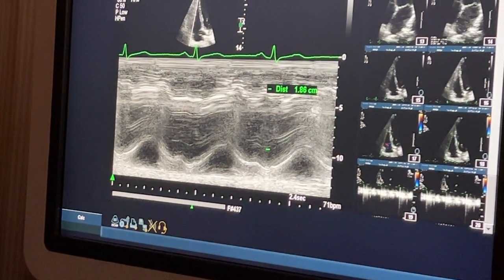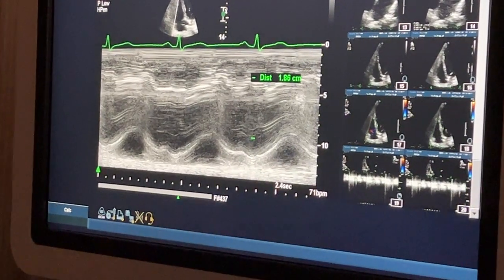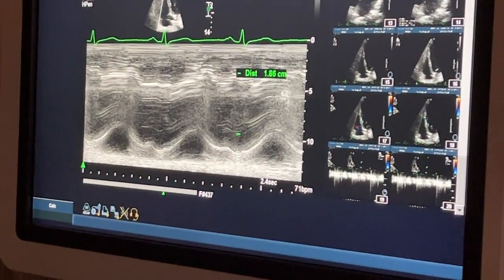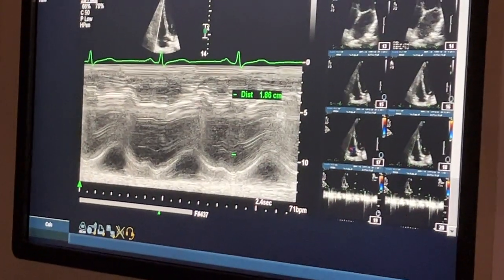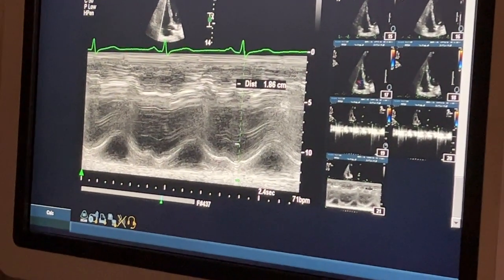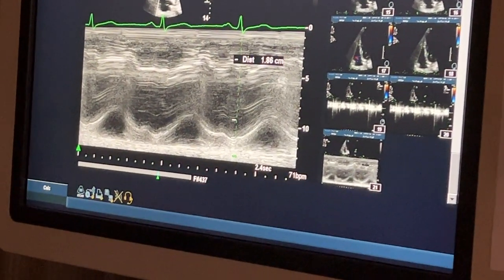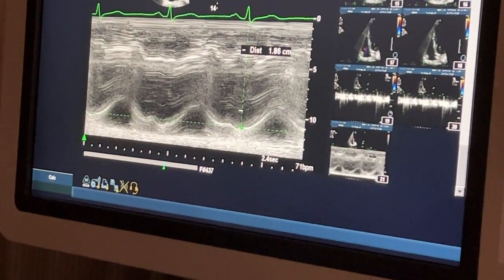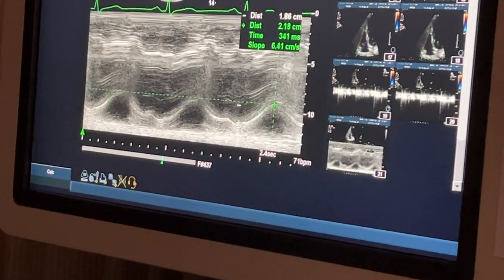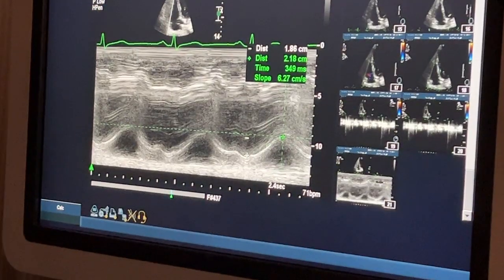I really don't like this method of measuring because I just have to hope that that's aligned. There is a much better way. I just went with caliper. Okay. Yeah. What I can do here is I can print this, and then how about this? How about I try to do distance? I didn't know that there's really a good time slope. Oh my gosh, this might be it. Yes! Okay. And I'm going from this line to this line. That's what I'm doing.